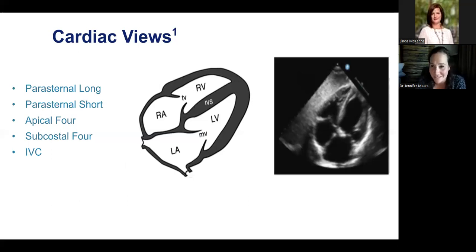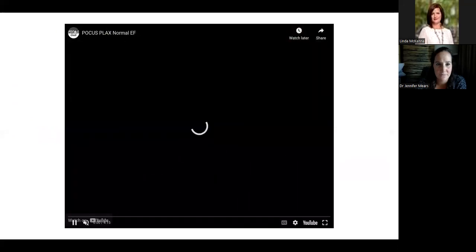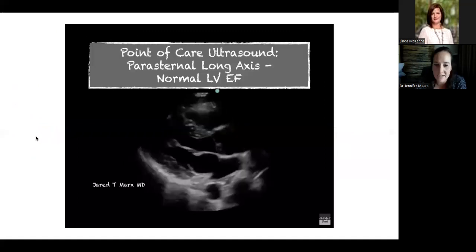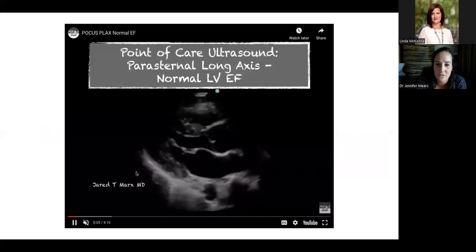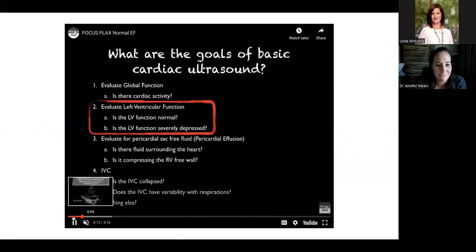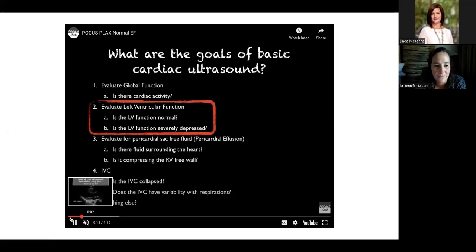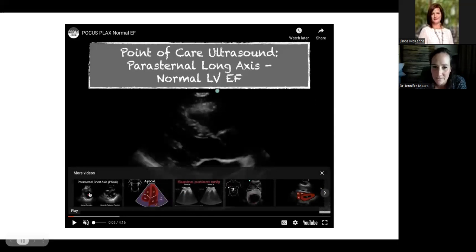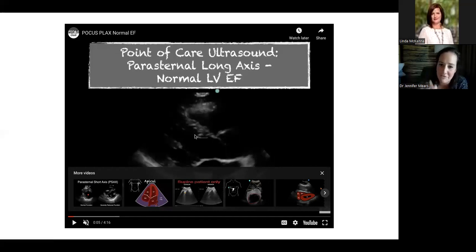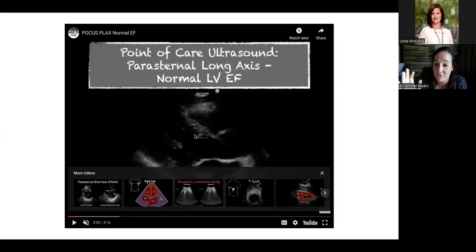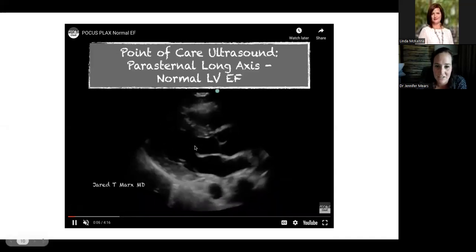Now looking at some video examples. This is the parasternal long axis — reorienting with left atrium, outflow tract, right ventricle, left ventricle. Some things to notice: the mitral valve, every time the heart beats, is almost hitting the septal wall. The last thing to notice is a concept called wall thickening. You see this hyperechoic line at the base of the septal wall — that line should travel intraventricularly every time the heart beats because the left ventricle beats in a concentric constricting pattern.